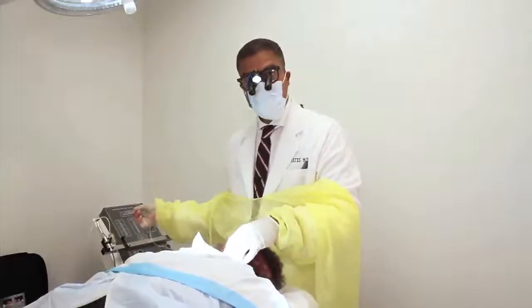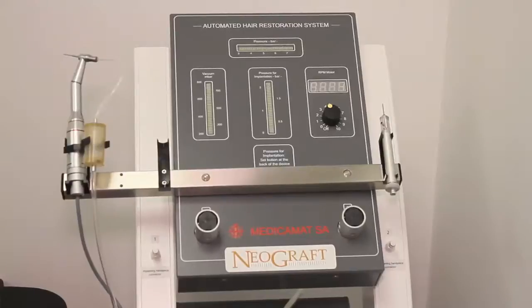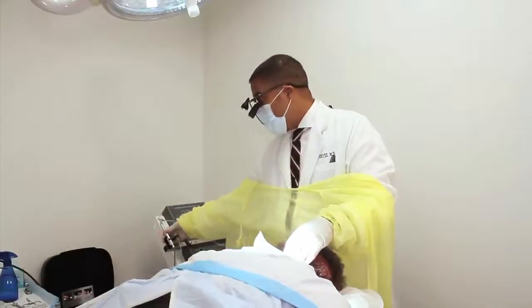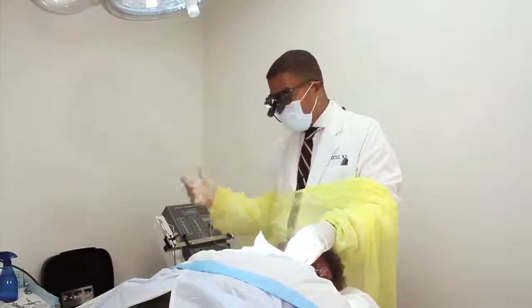Here's a NeoGraft over here. A lot of patients will come in and say, 'I want to get the NeoGraft procedure.' And I know right away they haven't read enough to understand. The NeoGraft is an instrument — a motorized sharp punch — which is just like any other punch.